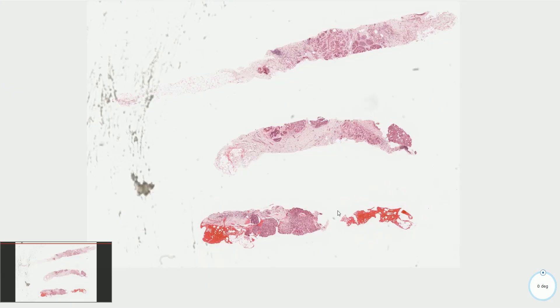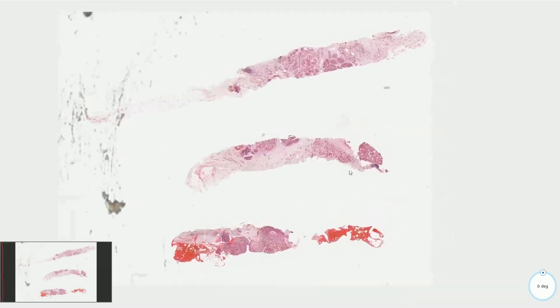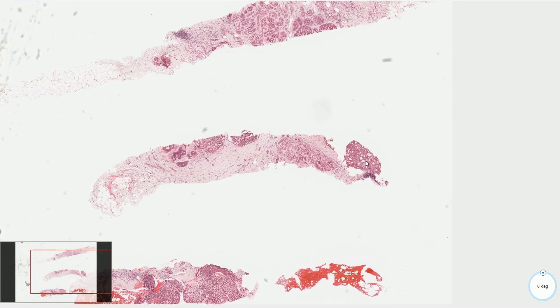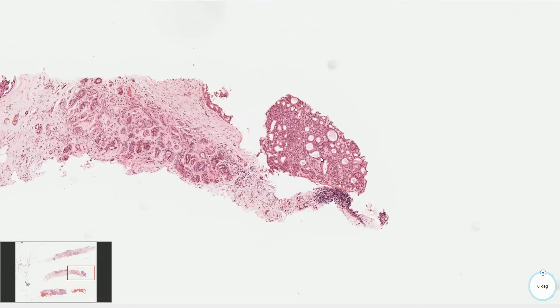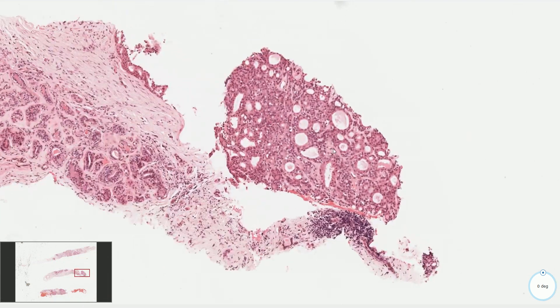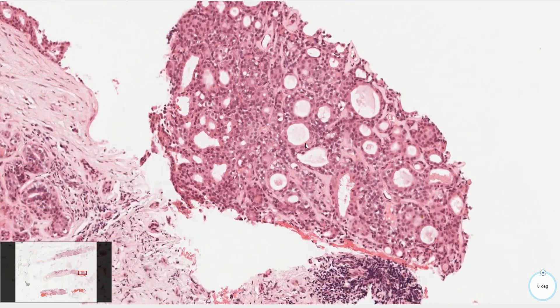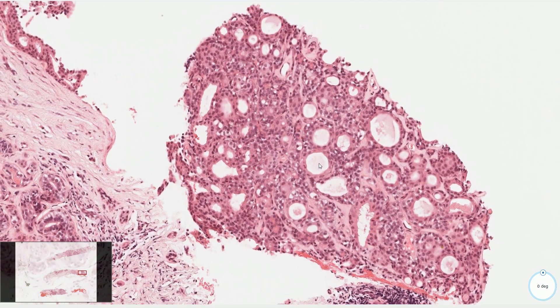This is another example of adenomyoepithelioma in a core needle biopsy. It may be very hard to make the right diagnosis from core needle biopsy because these closely packed structures can look very worrisome, but the clue is the prominent myoepithelial component, and immunohistochemistry may be very helpful.